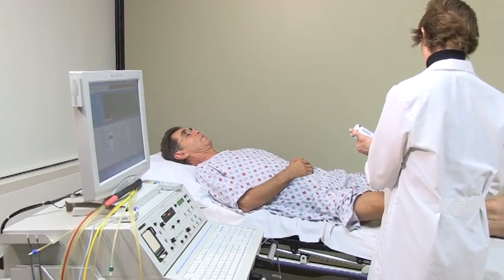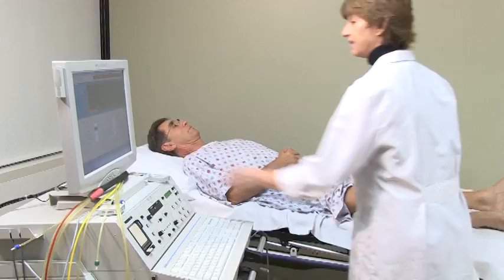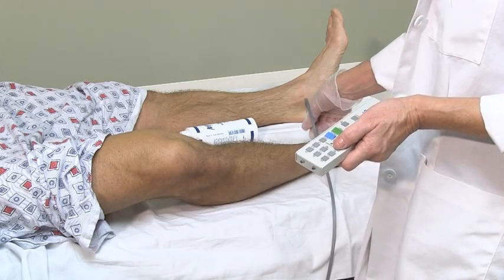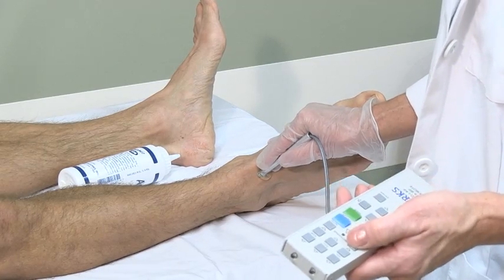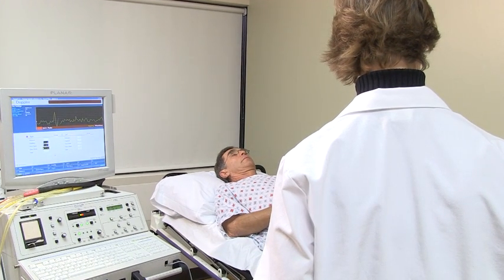Using an ultrasound probe, the technologist will listen to the pulses in your legs at the groin, knee, and ankle levels, or your arms at the chest, upper, and lower arm levels. You will hear a swishing noise as we measure the pulses.